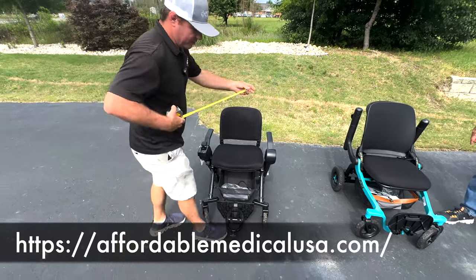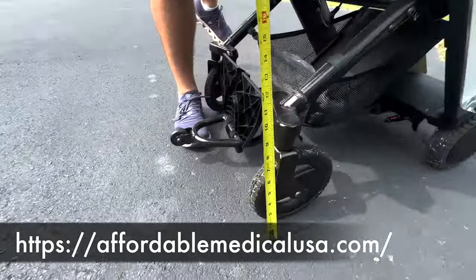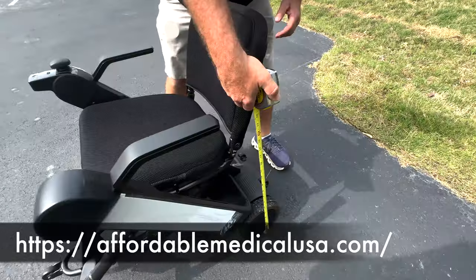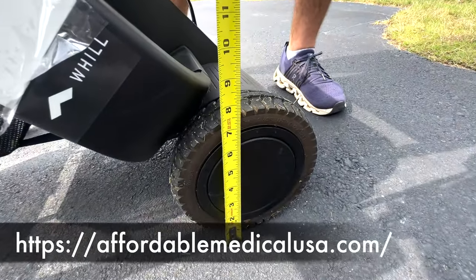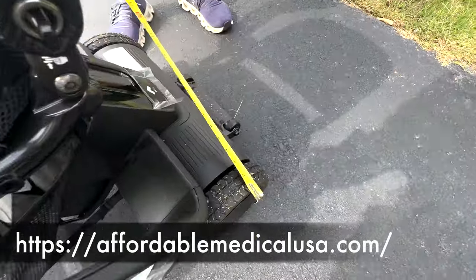The tires on this particular unit are about 7 inches at the front. The back tires are about the same, just a little bit wider if you see the width.